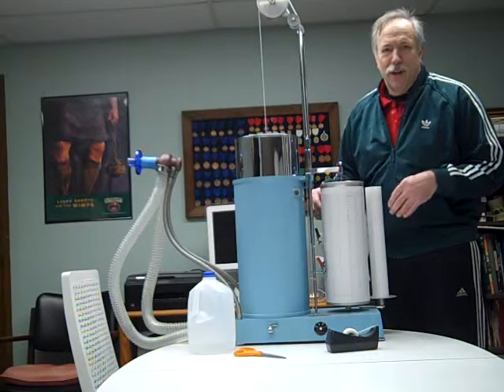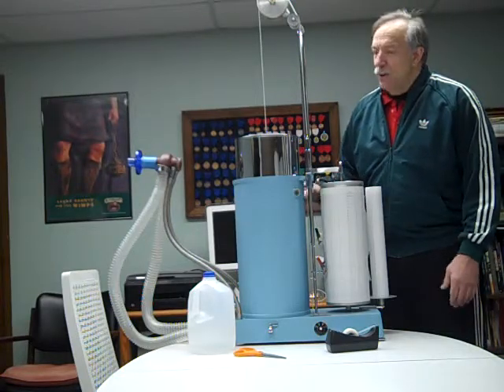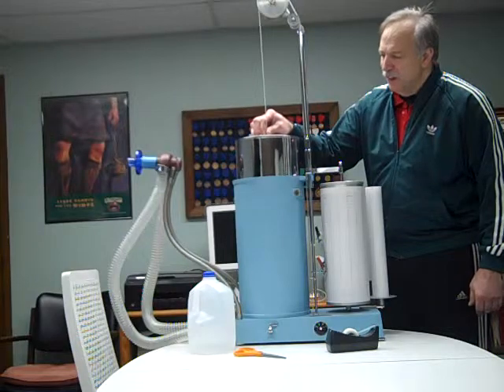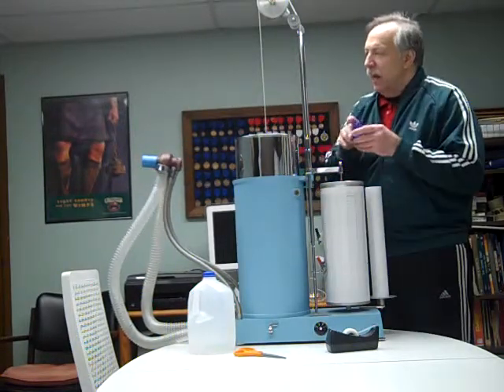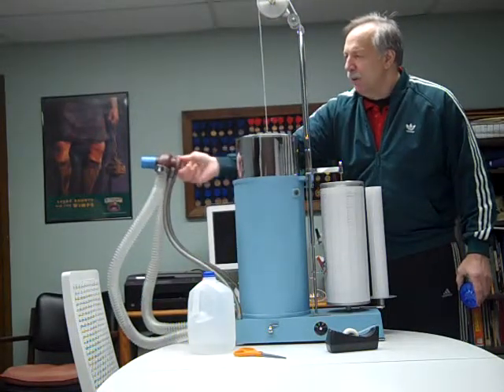Today we're going to show you the Collins 13 and a half liter water sealed spirometer. The water is actually held in this drum and it encases this bell — as the patient breathes in, they push air in and they push air out of the drum.